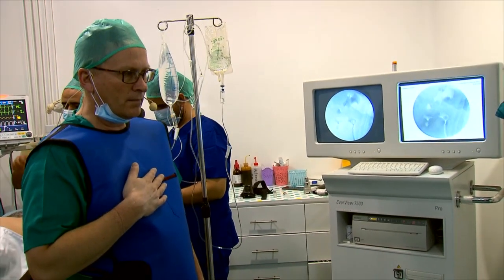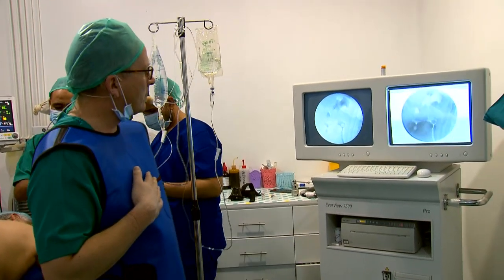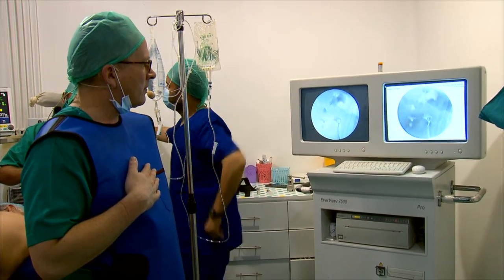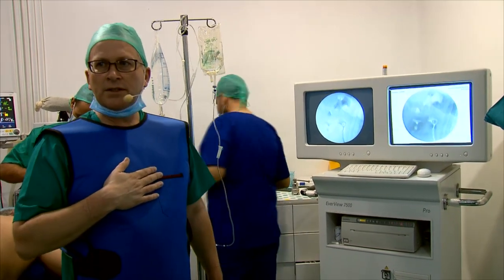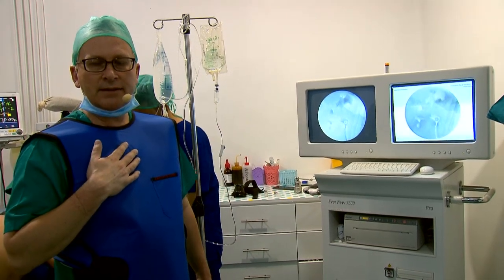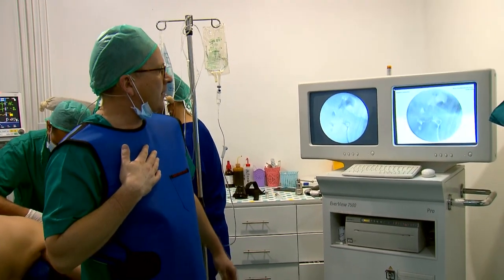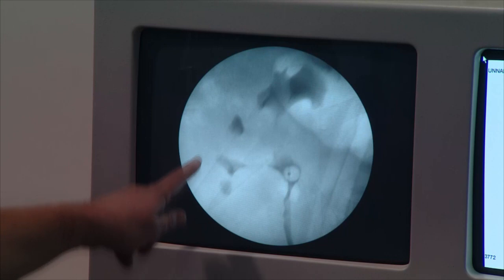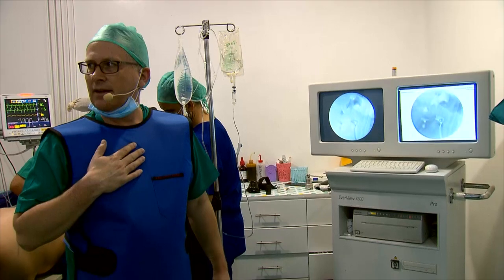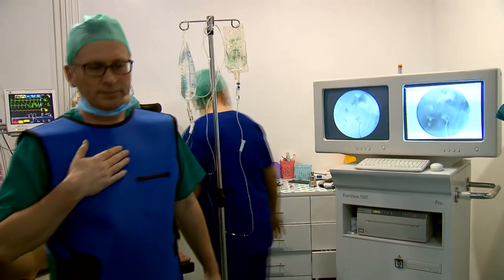But all is good. Like you have said, you can do it whenever we want. But just, the two stones are in the communicating calyxes. The patient is pre-operated, which means that we might expect some scars, a narrow calyceal neck. But just wait a few minutes. After we apply contrast dye, we can discuss this area once more. Another 5 minutes, and we will be back and discuss this point again, okay?